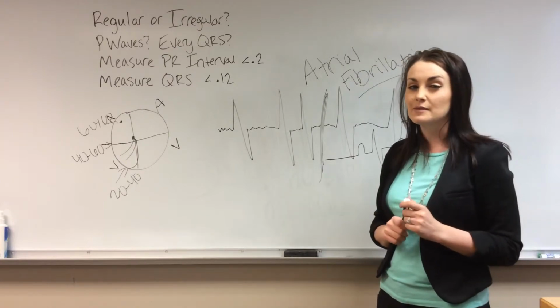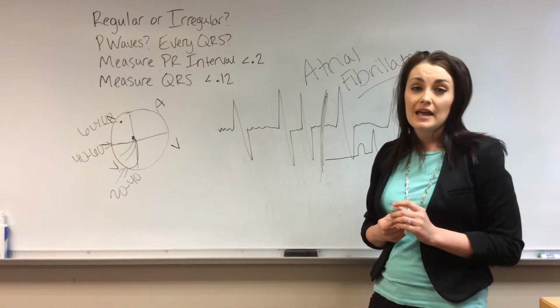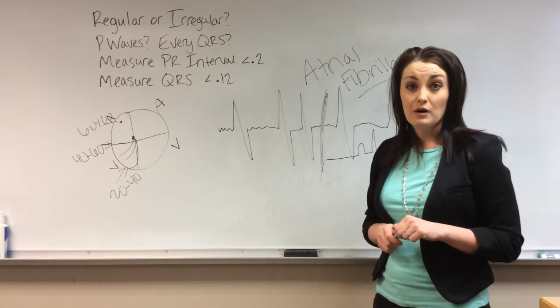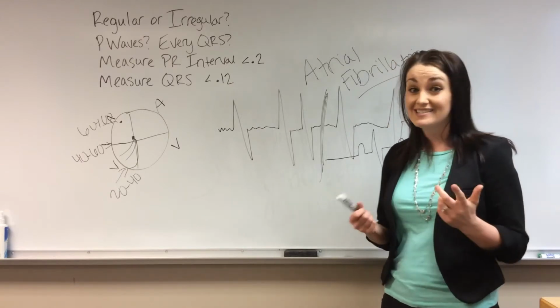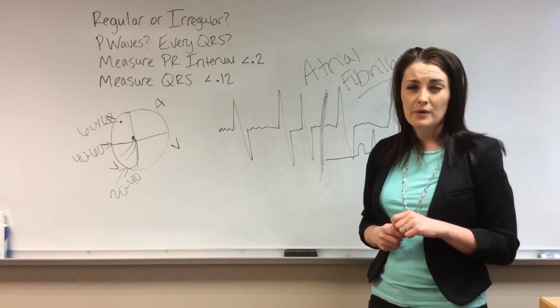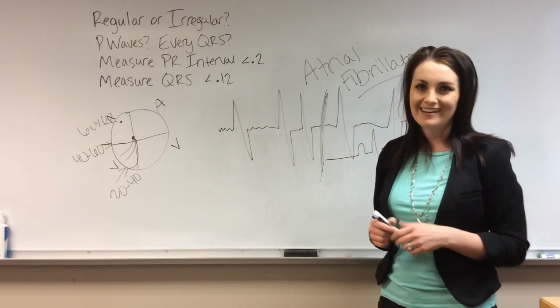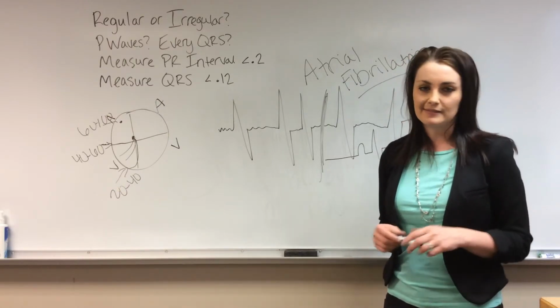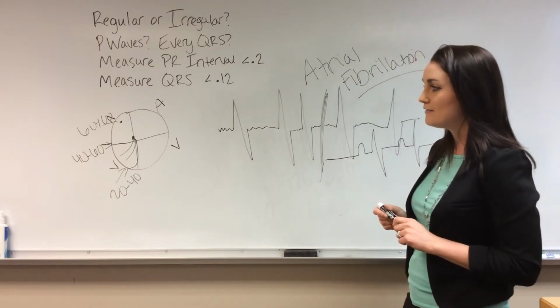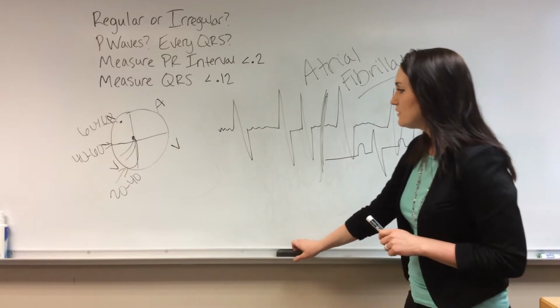So cardioversion is something that you'll see done a lot in the ICU, and also in the ER as well. We can do it with light sedation, Versed, fentanyl, but we always have anesthesia and the physician available. It's a pretty controlled thing, but can be done electively, and oftentimes it works. So that's atrial fibrillation.